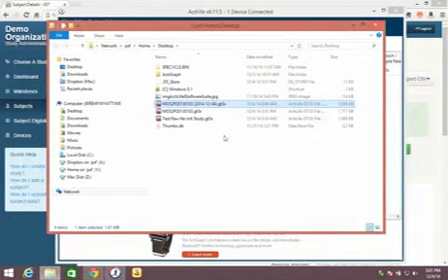Some of you are thinking, well, why do I have to get the device? Pretty soon that will not be necessary. We're working towards making these raw data uploads available at each site level. We're looking at early to mid-January to have that option ready. But we wanted to give you the option to preview this before the end of the year and give you the option to actually use this if it sounds beneficial.